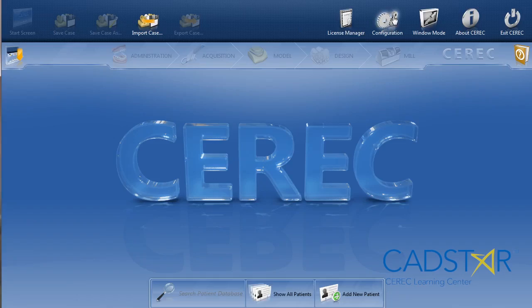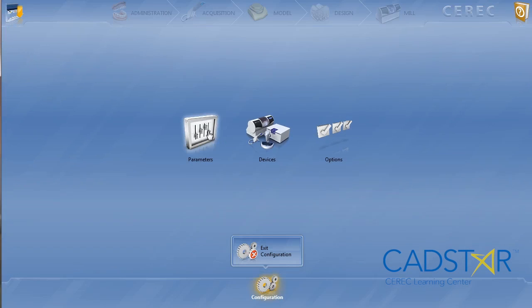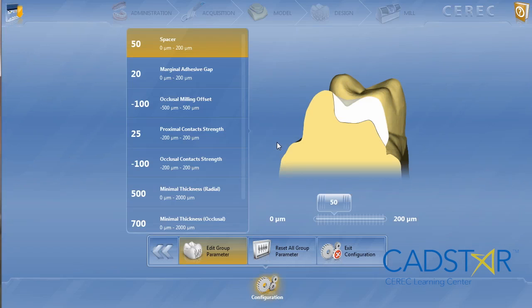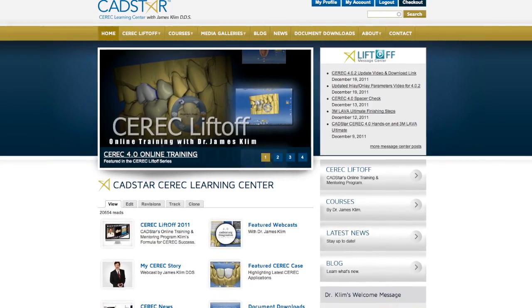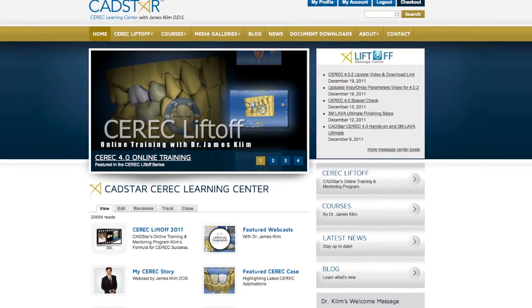Why don't I hit the parameters for the 4.0 inlay/onlay? You will find more in-depth discussion at my online teaching and mentoring site, cadstar.org — CEREC Liftoff. Let me hit the parameter metrics for inlay/onlay in 4.0.